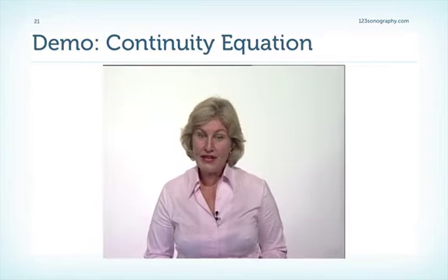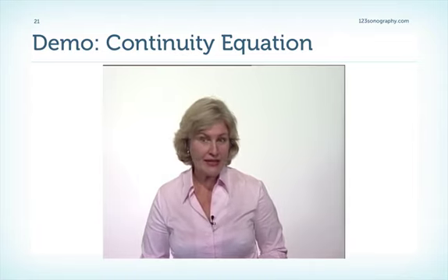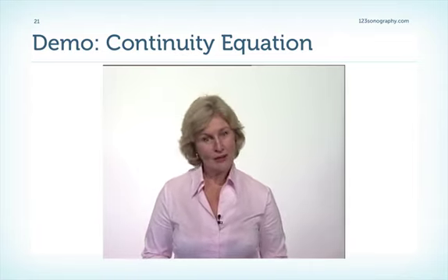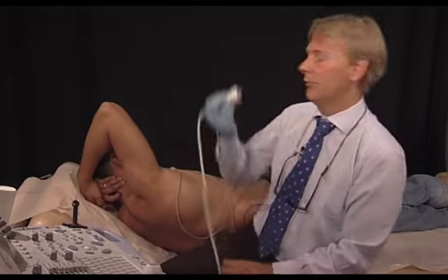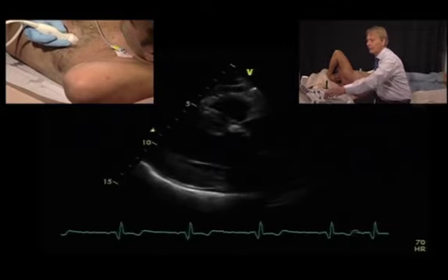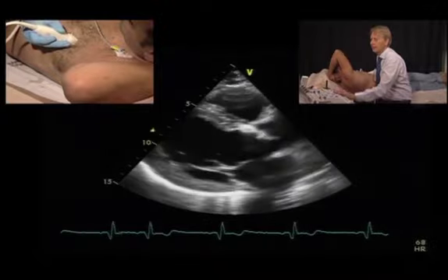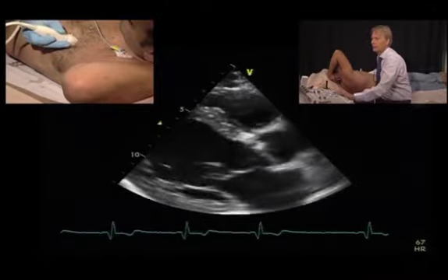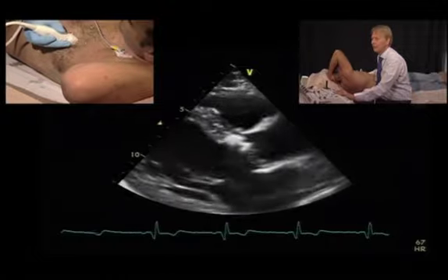So, from theory to practice, now let's see how to really acquire the parameters you need to calculate the continuity equation. And Tommy will now show you how to do this. To quantify the aortic valve area with the help of the continuity equation, we start from a parasternal approach, because we first of all need the diameter of the LVOT. So we'll optimize our image here. It's important to get the aortic valve as large as possible on the screen to reduce the measurement error.